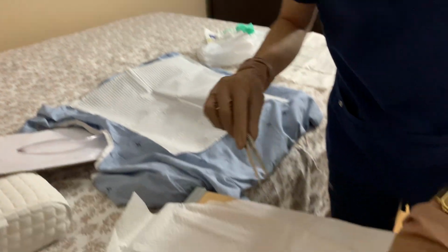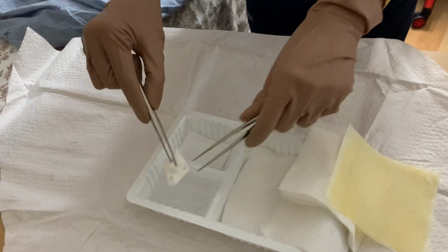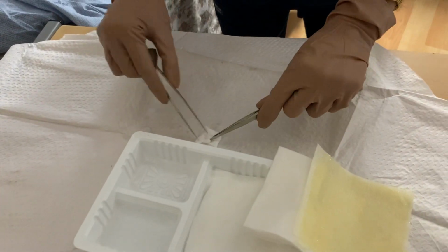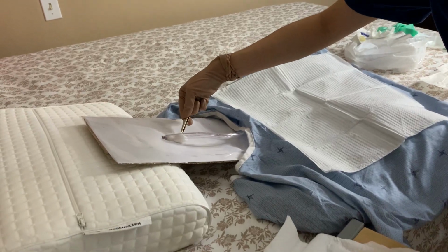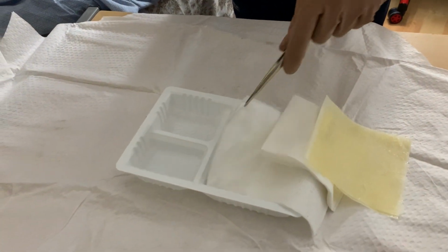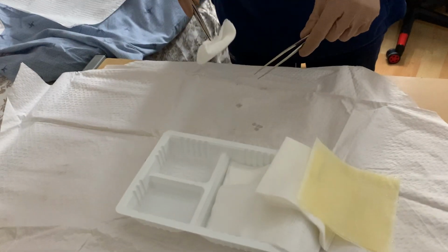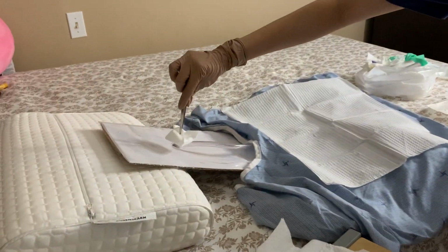Okay, now I'm going to clean my tube. Okay, and now I'm going to clean under. Garbage. Okay, and now I'm ready to dry my site. I'm just going to grab my 4x4. Making a rosette. And as you can see, it's a little damp from before, but it wasn't because of me putting it in the normal saline. So I'm just going to dry it now.